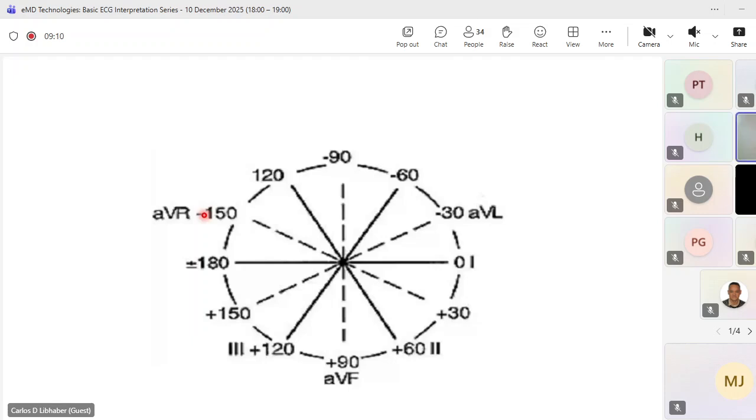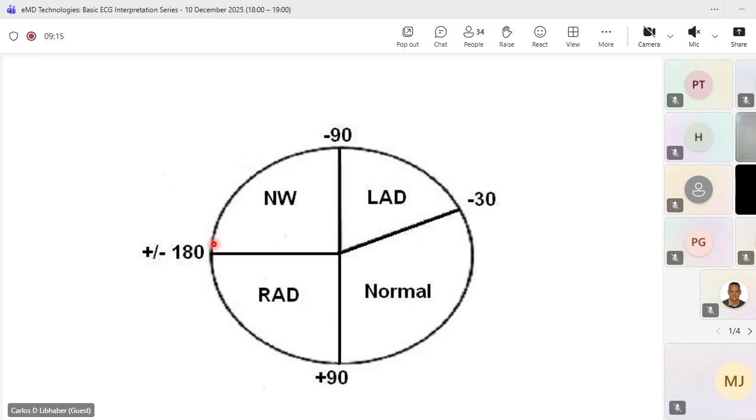We go back to the helicopter. If you are sitting on a helicopter and a car is coming through the highway, you can easily tell me the car is coming towards me or the car is going away from me. The car is going 90 degrees from me or is coming towards me.